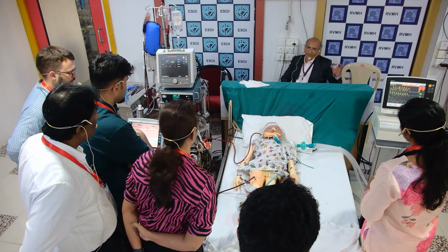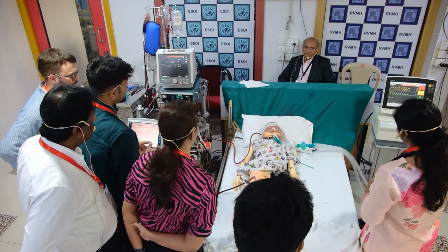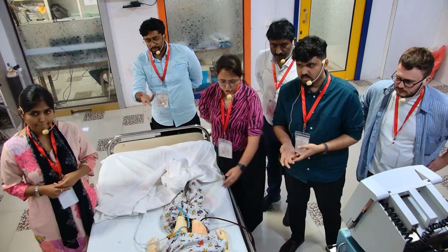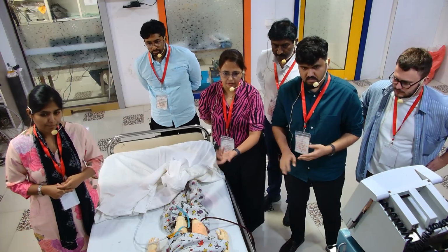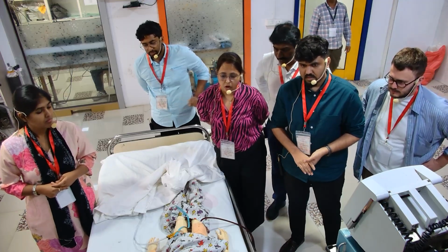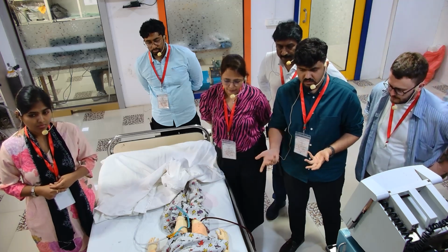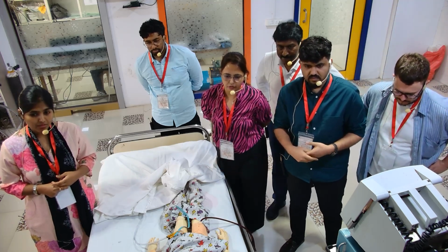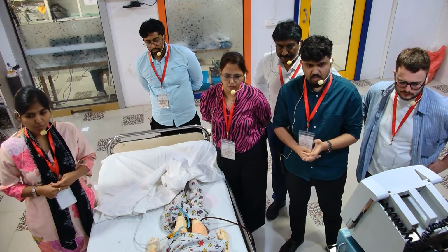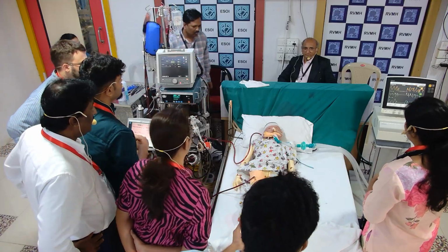Suppose there was no kink at that point. What other thing could have been? There might be volume status issues, which we already addressed with fluid boluses. There might be internal bleeding, so we would check for it. We also checked for cannula movement. Has the cannula been displaced? We only checked the cannula site for bleeding. Or we would have checked if the demand is increased, like the patient is agitated or awake. When we asked about the blood, what was the hemoglobin? We thought of internal bleeding, but you already said the hemoglobin is 10.